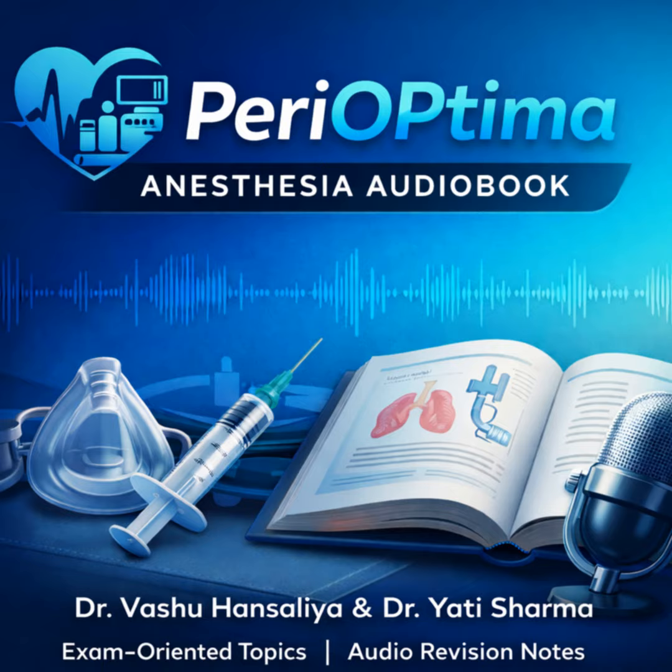Bleeding is another constant threat, especially with the nasal route. Yes, and it's a failure risk. Right. It's best prevented with good vasoconstriction. If it happens, you need immediate focused suctioning. If it's massive, you might have to abandon the attempt. What about the most common technical problem?